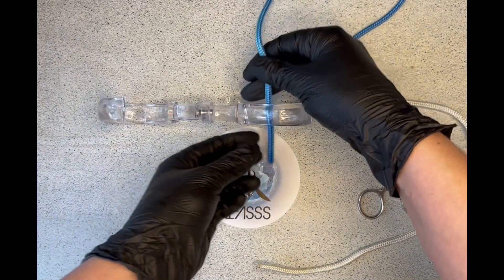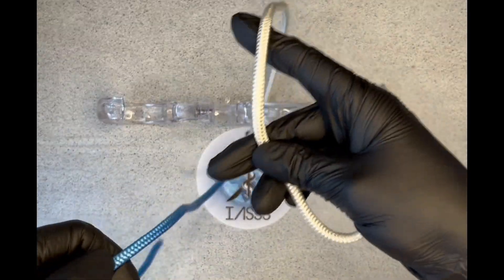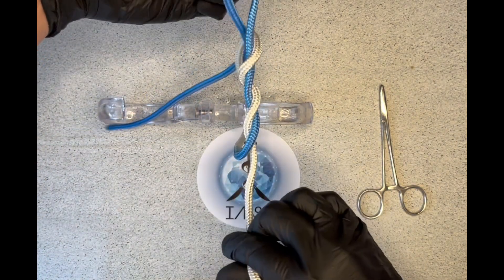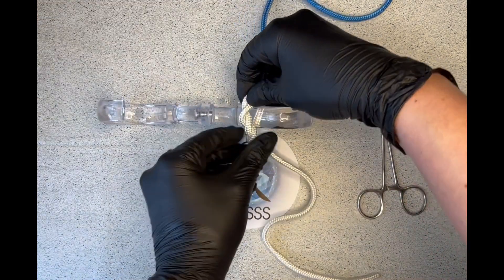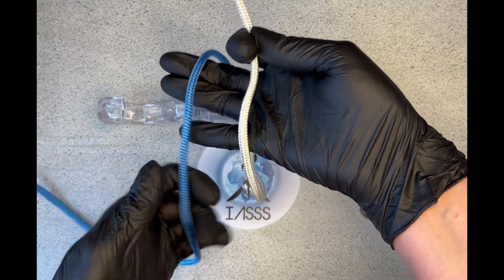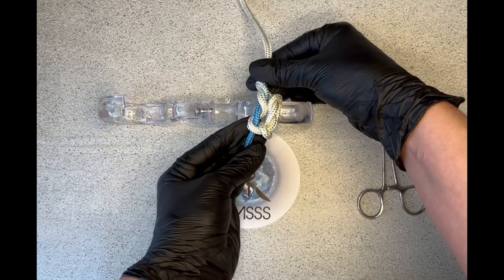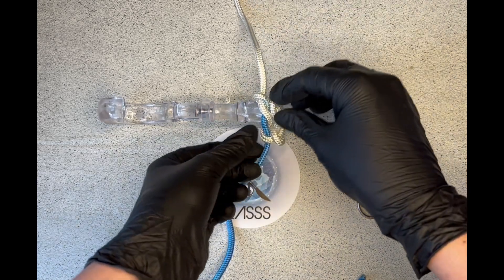Now for the last one — a surgeon's knot — which is basically a reef knot with a double throw. Again we've brought the suture material through towards us, middle finger and thumb with the extended index finger. Here you do the first throw and then allow a second throw to happen as well, so you have two throws that have gone around. When you place that down you can see that instead of one single throw it's two. The same thing happens on the other hand — flip it over, create the second loop, and instead of a single throw you double throw it. As you can see it's gone round twice and that becomes a surgeon's knot. It's basically a double reef knot, a very stable knot, less likely to slip, and it will stay in position — it won't tighten further once placed in the tissue.